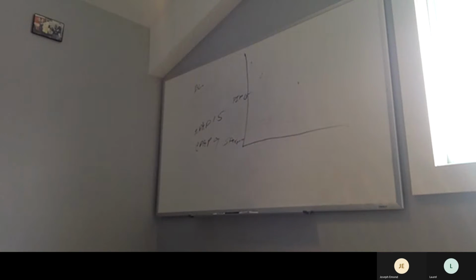We're going to start out the machine like we just did before in CPAP. Put it on the board, so somebody write it down, CPAP. And let me breathe a couple breaths on that, okay? And we'll start the CPAP at 5, because that's what it fires up at. My lungs can handle the CPAP at 9. I do all right at 9.